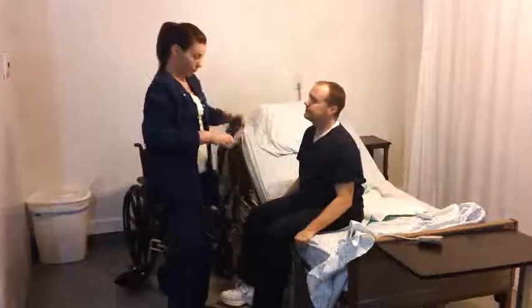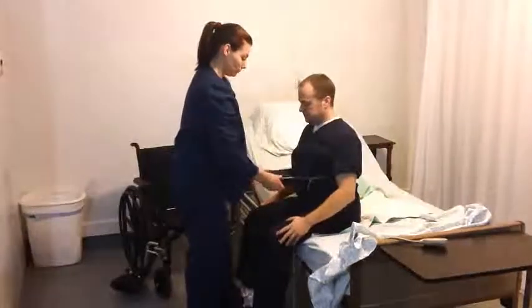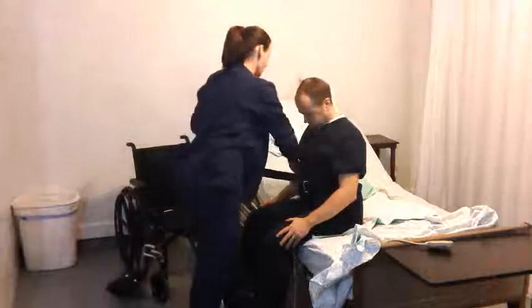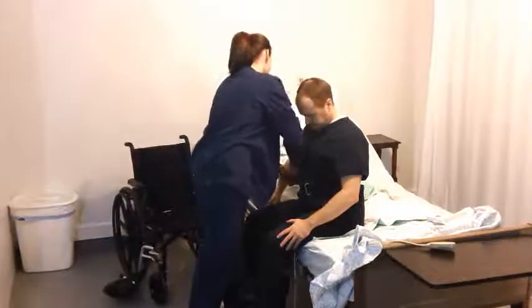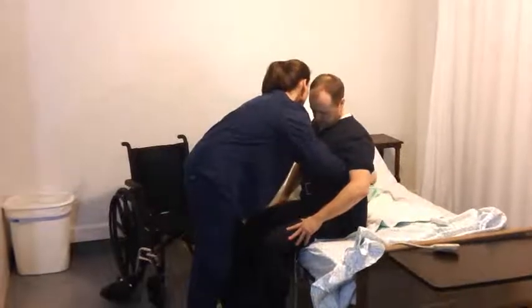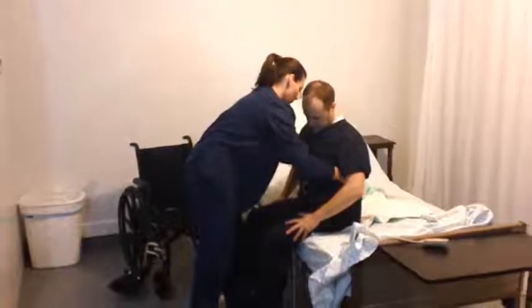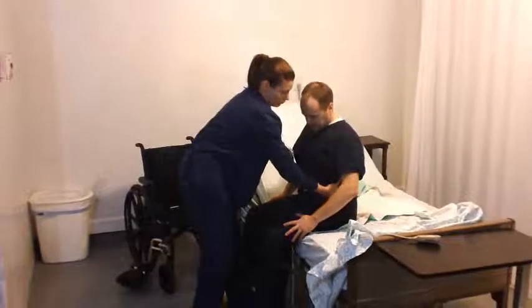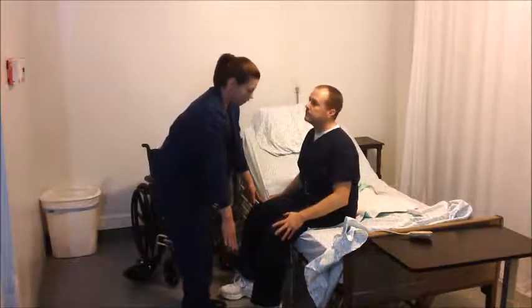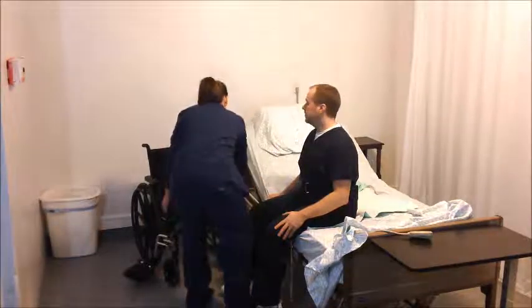Apply the transfer belt securely at the client's waist over clothing, secured so that only flat fingers or a hand fit under the belt and the belt does not catch skin or skin folds. Position the client's feet flat on the floor and provide instructions to enable the client to assist in the transfer, including a prearranged signal to alert when to begin standing.